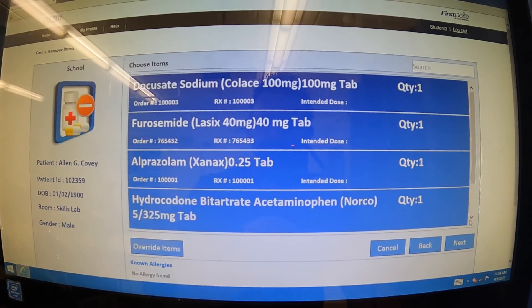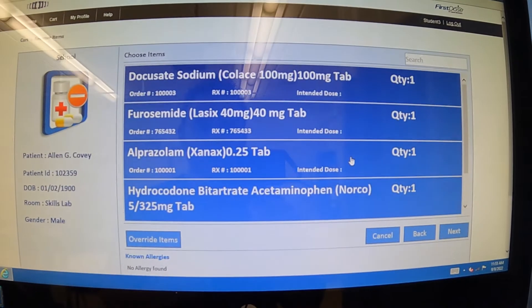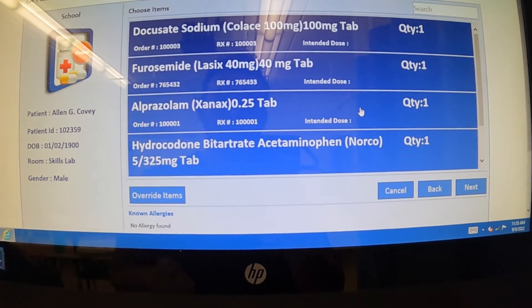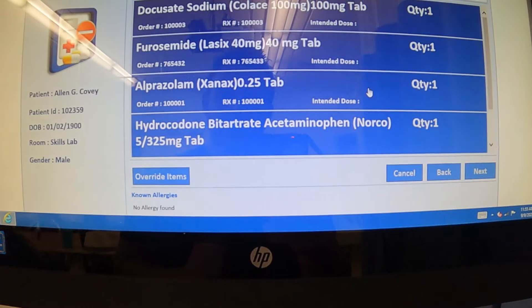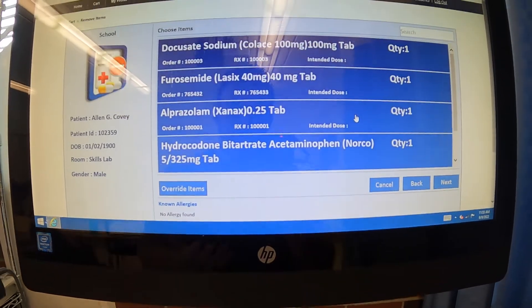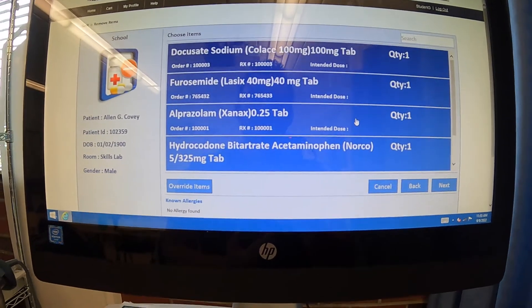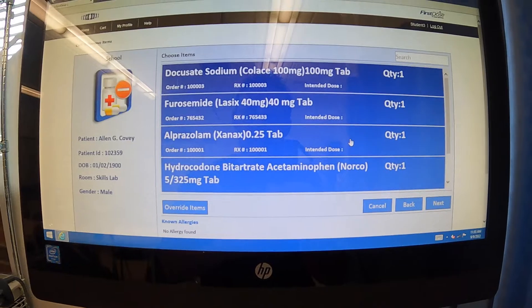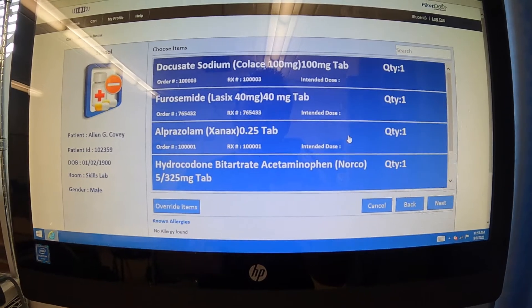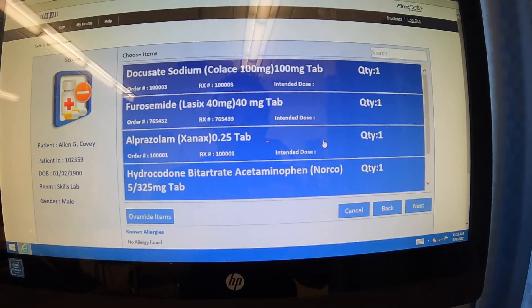It's going to bring up all the medications that this patient has ordered from the doctor. What you're going to want to do is select the one that you're going to be pulling, and you want to make sure that it's the correct medication, the right dose, the right route, all of those things. Think of this machine kind of as a vending machine of medications. When pulling medications, we want to ensure we're pulling the right ones, because this is traditionally stocked by the pharmacy department, and sometimes they might accidentally put a medication in the wrong bin or give the wrong dose. So we have to make sure we're doing our safety checks and pulling out the right medication.